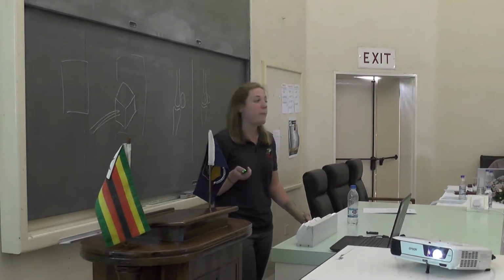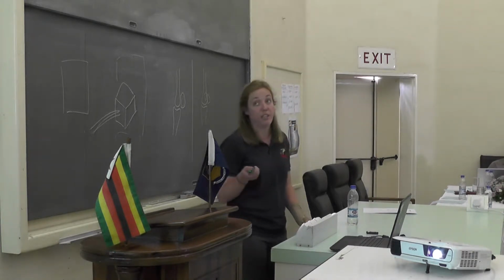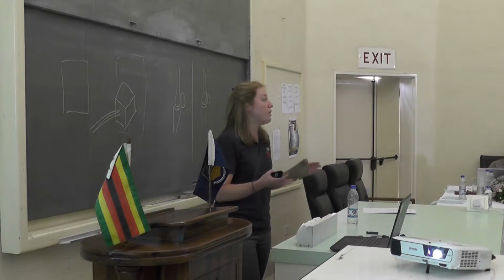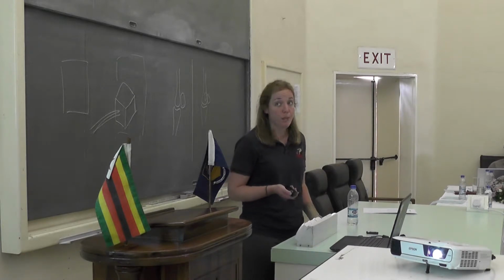Other important things to remember is to remember what is radiolucent and what is radio-opaque. So Ben showed a picture earlier of the horse being X-rayed through a bandage, which we do very, very often in equine practice because they will normally have a bandage for a reason. If it's protected, if you suspect a fracture, so you don't want to necessarily take off that bandage to be able to see the bone, but that's fine because what's in that bandage, so all your cotton wool and all of that, is radiolucent, so that allows the X-rays to penetrate and give you the image of the radio-opaque structures, which in this case would be your bones.